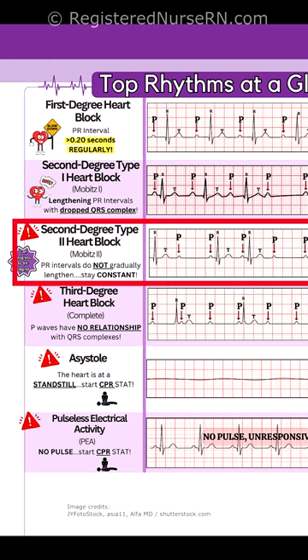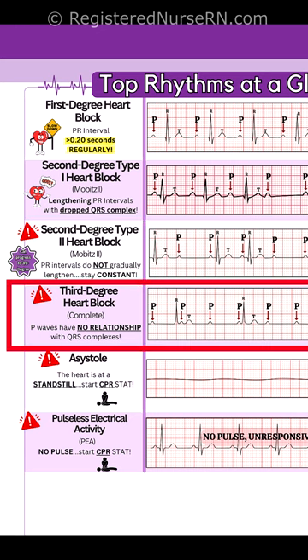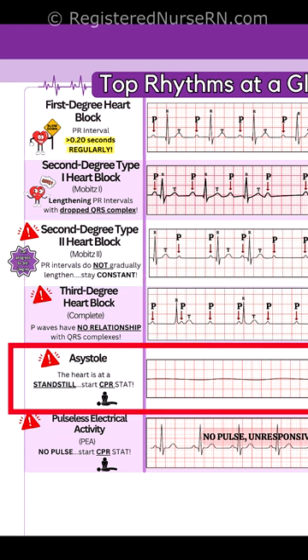Second degree type 2 heart block: the PR intervals do not gradually lengthen but stay constant. Third degree heart block: the P waves have no relationship with the QRS complexes.